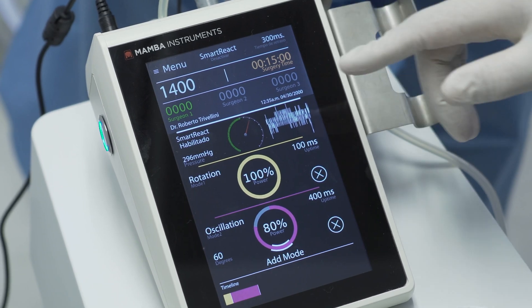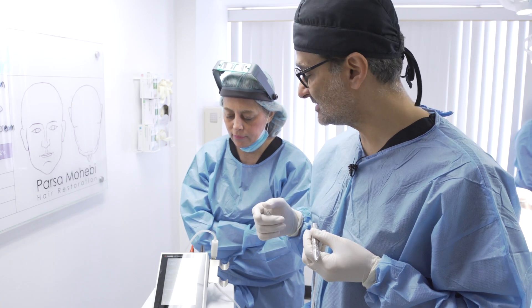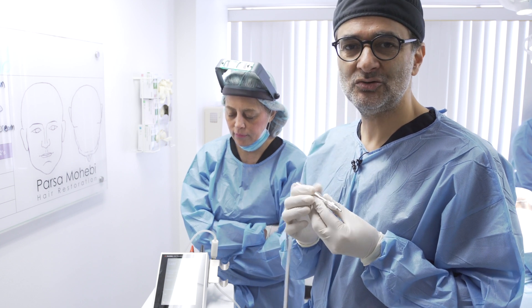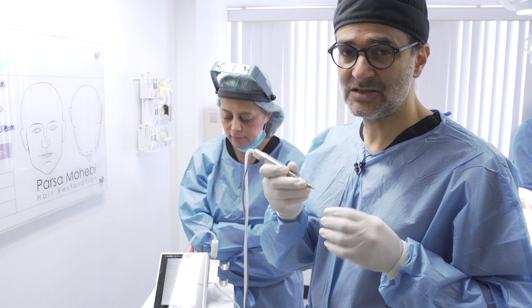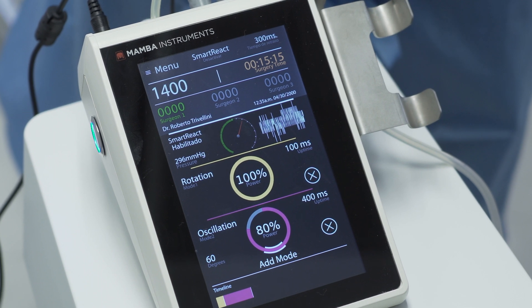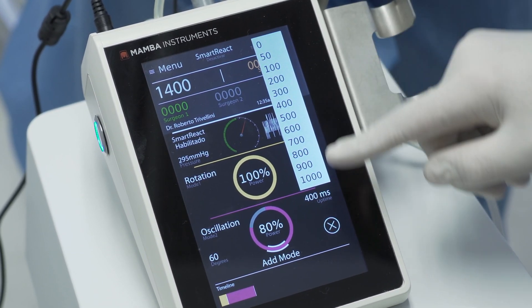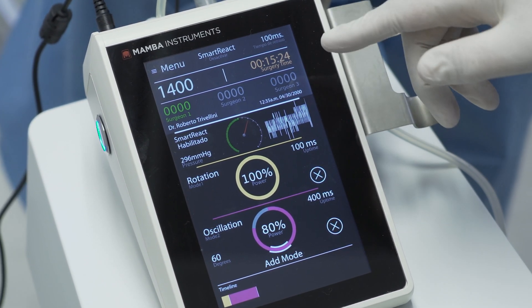You can change that. You probably want to start with a higher number at the beginning if you're just starting with the system, until you get used to it. After a while, when you get used to that timing, you know you can center and focus a little bit faster. So you may feel that 300 milliseconds slows you down, and you may want to bring it down. You can click on it and bring it all the way up to 1000 or bring it down to 100 or maybe 50 milliseconds.